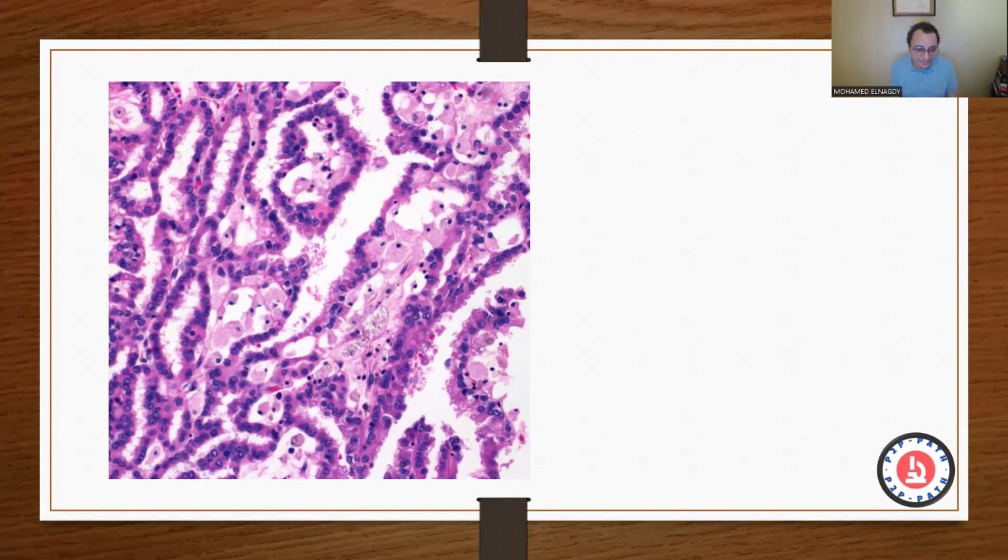Okay, so it seems that it's papillary. So why did you say this is papillary? First, let's say this is a light blue. It's not really blue, it's kind of bluish. So if we're saying bluish, you're saying that this has some kind of papillary architecture. So why did you say papillary?